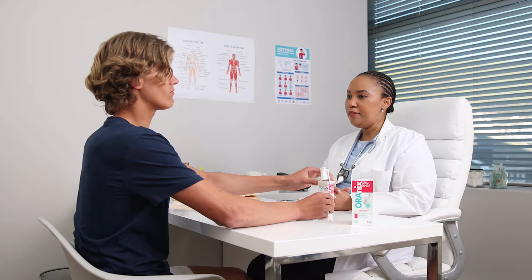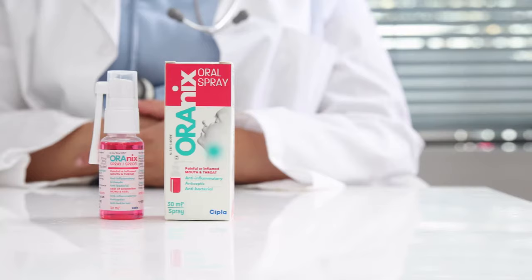Always ensure that you use your device correctly. For any further information, consult with your health care provider.